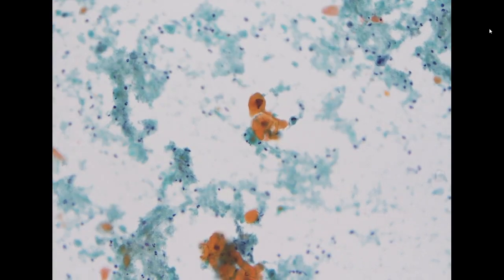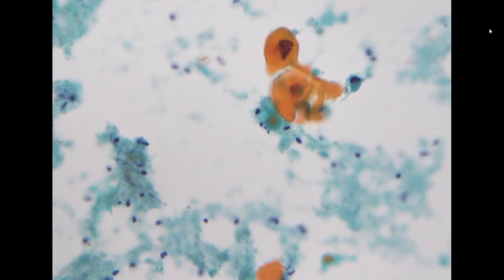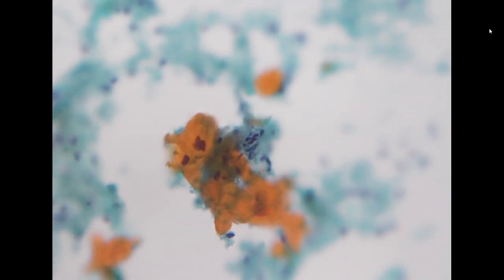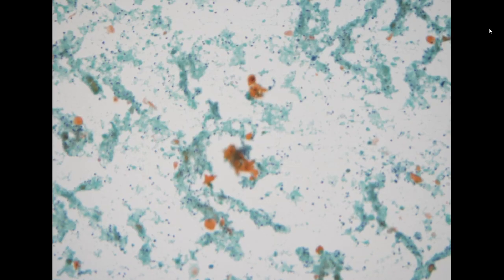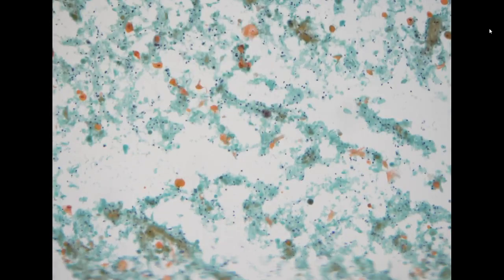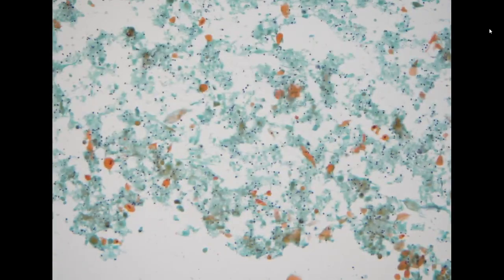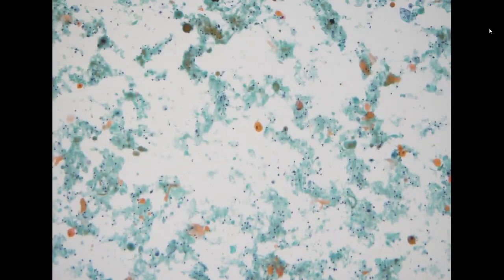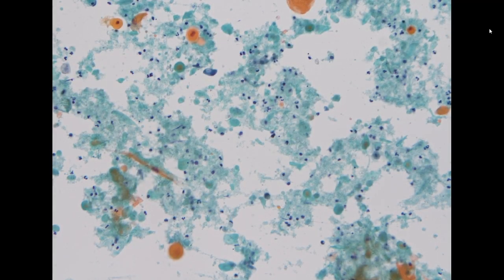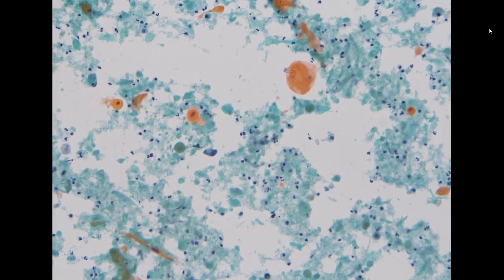We only have keratinized cells here, but because it's a pericardial effusion, there's no way there would be a benign squamous cell lesion inside this area, and the patient shows a definite history of esophageal squamous cell carcinoma. So this is positive for squamous cell carcinoma. It almost looks like a rupture of the tumor inside the pericardial cavity.